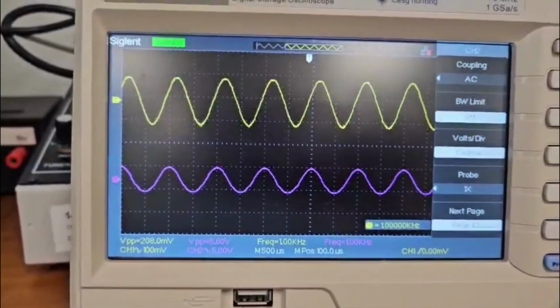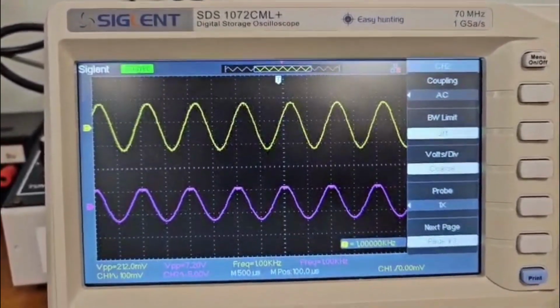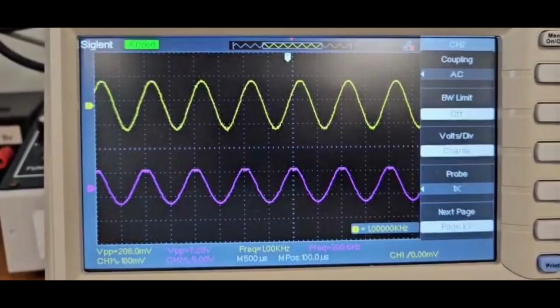By adjusting trimmer P2, which acts as a volume control, the output voltage at TP5 gradually increases. I recorded a peak output of about 7.2 volts just before saturation occurs. This shows that our system is effectively amplifying a weak heartbeat signal from the microphone into a clear, strong audio signal, powerful enough to drive a speaker with minimal distortion.